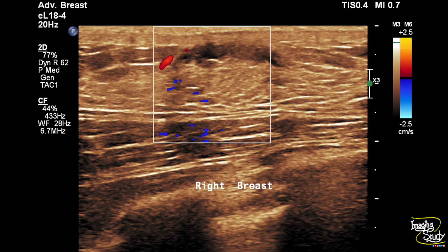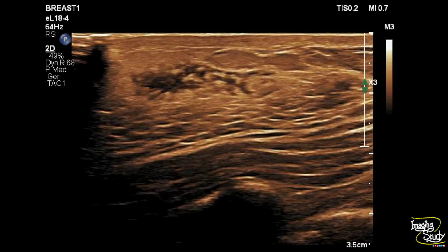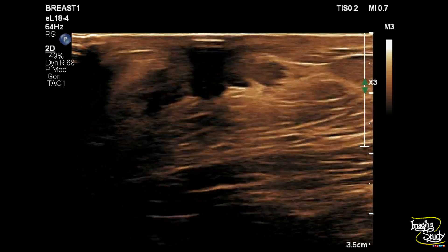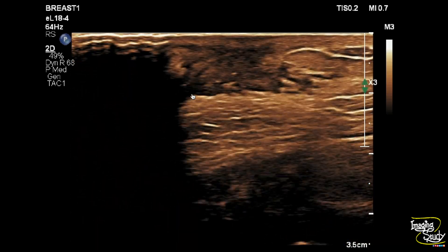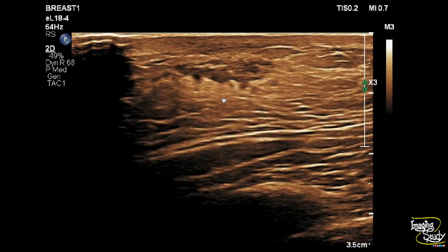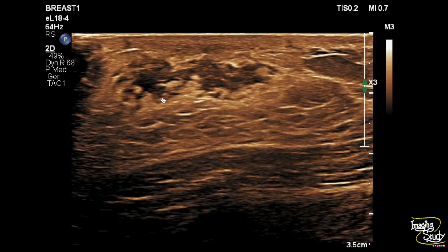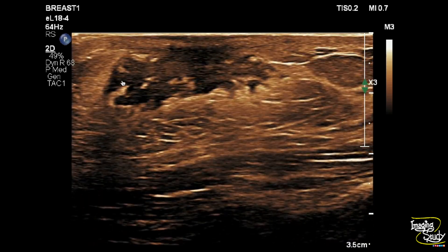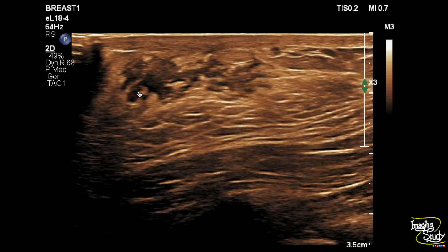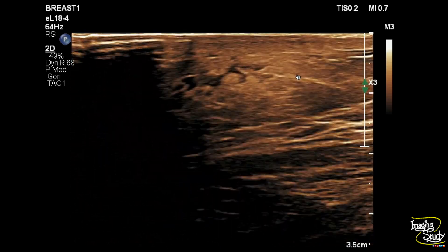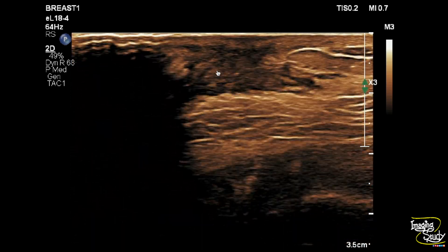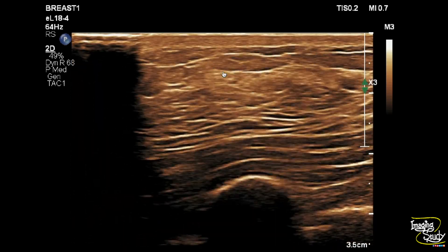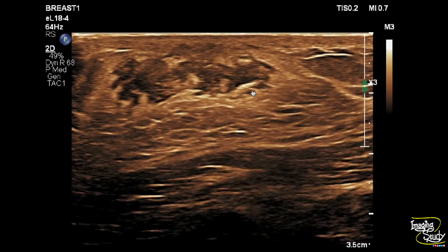Now let's look at the left breast, for which the patient came. Here you can see the left breast region shows an irregular hypoechoic area at the left retroareolar region. The surrounding fat plane appears irregular, which indicates the possibility of an inflammatory process. This is the proliferated mammary layer along with some proliferation of the mammary ducts.